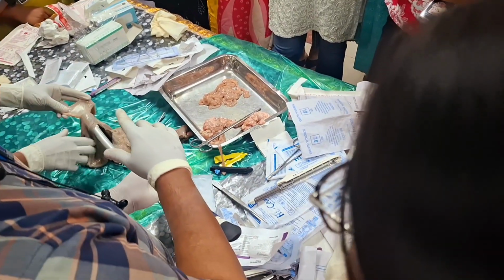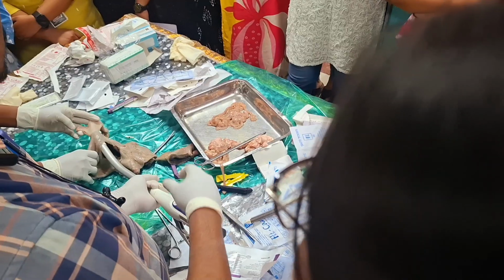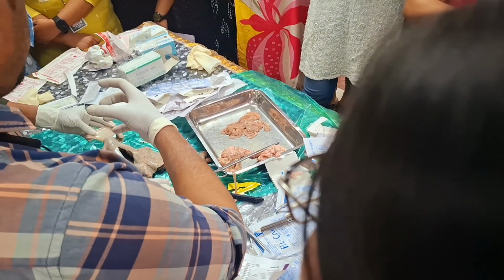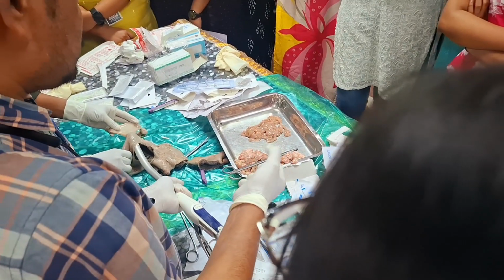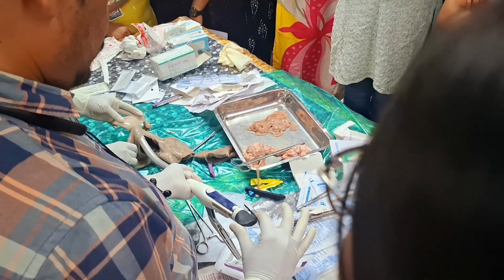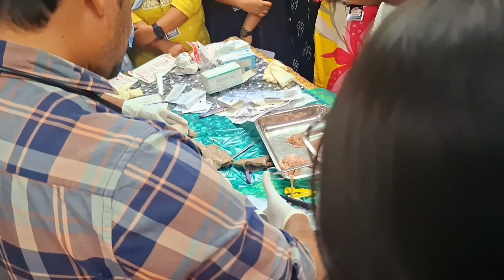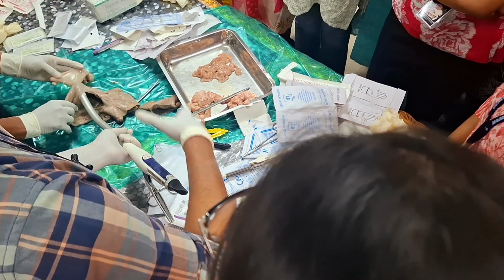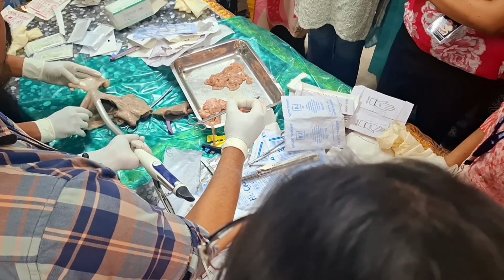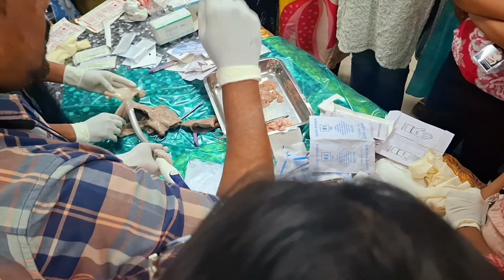Why that click occurs is because this has a small tactile click. Once this senses that both the bowels are approximated, you should not twist more because you are going to crush the bowel. You should not crush the bowel. Keep it exactly where you got a click. Usually there will be an indicator. Now while firing, you will have two rows of staples, which will staple in a circular manner, and it will still have a knife inside.